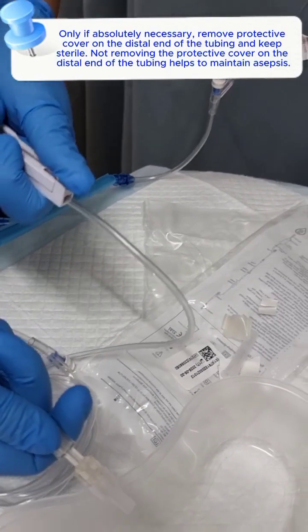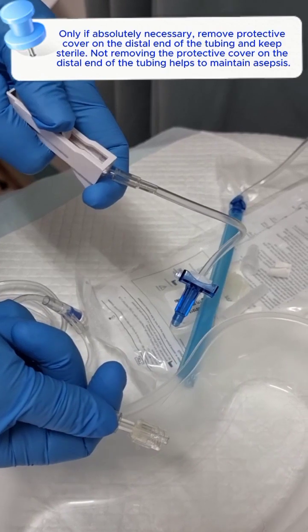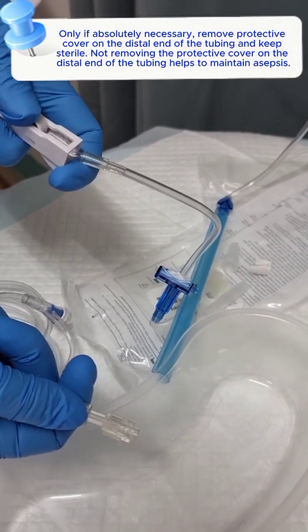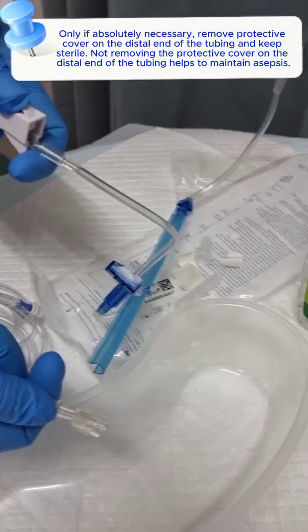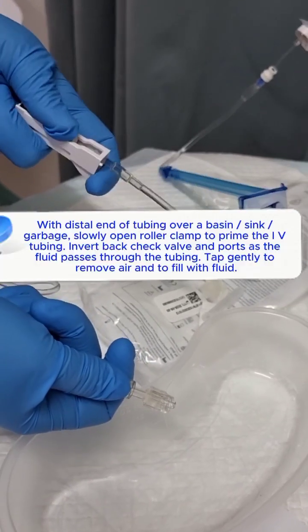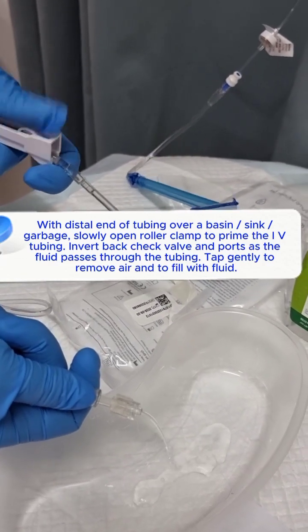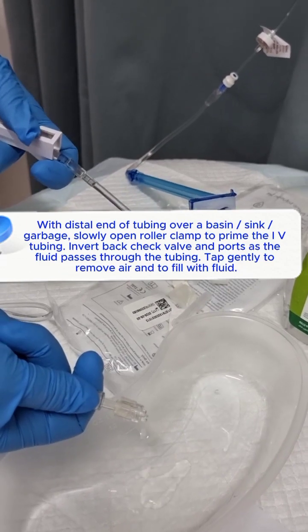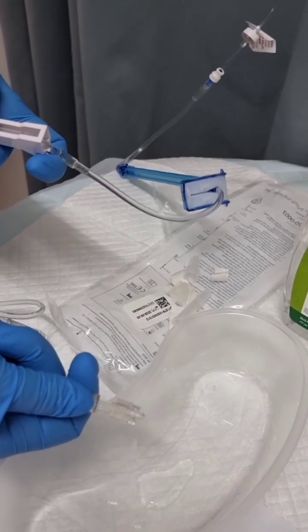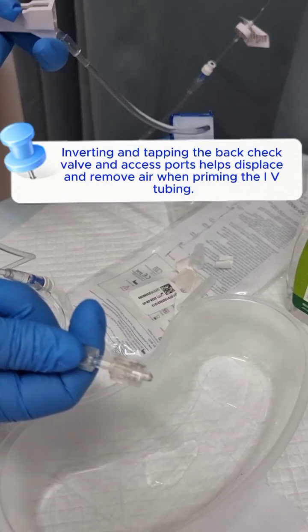Only if absolutely necessary, remove the protective cover on the distal end of the tubing and keep it sterile. Not removing the protective cover on the distal end helps to maintain asepsis. With the distal end of the tubing over a basin or sink, slowly open the roller clamp to prime the IV tubing. Invert the back check valve and ports as the fluid passes through the tubing. Tap gently to remove air and fill with fluid. Inverting and tapping the back check valve and access ports helps displace and remove air when priming the IV tubing.